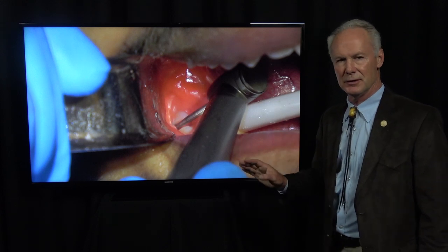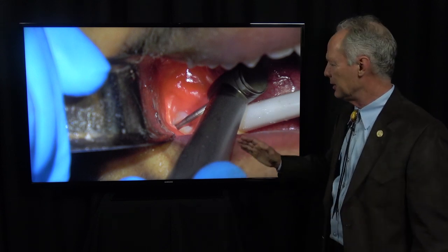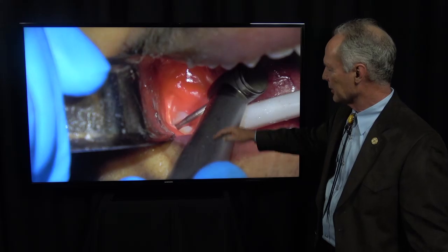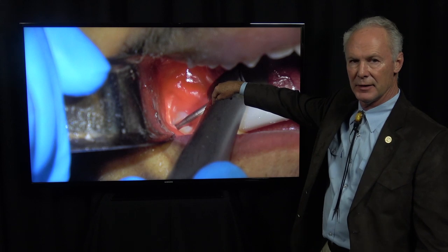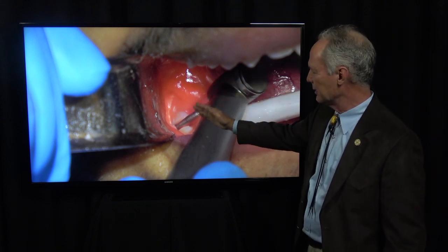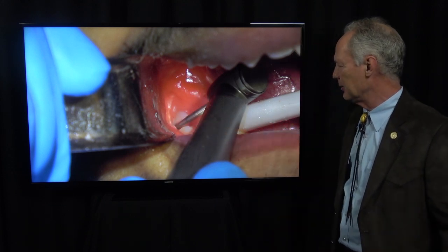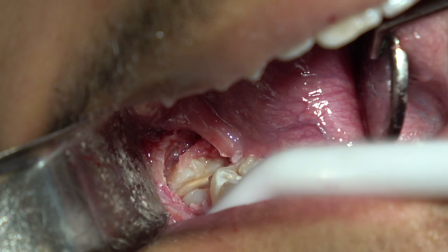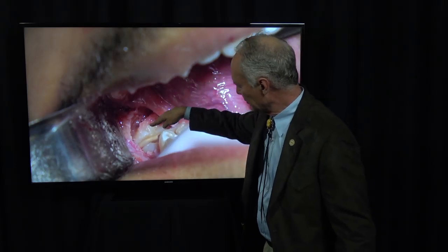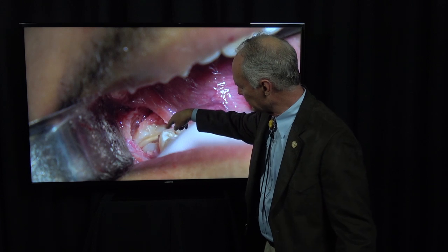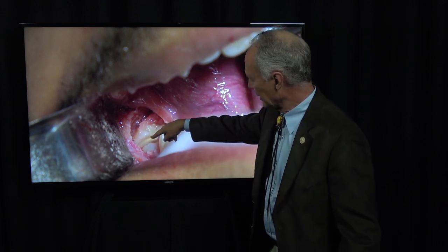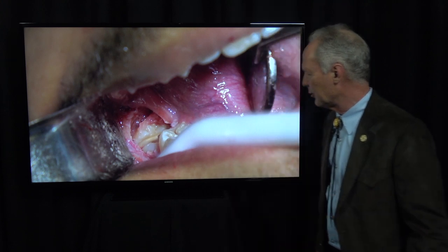It's very important if you're using a high-speed handpiece that you not reflect the lingual tissue, because you don't want to create an air embolism — that's from air getting down into that lingual tissue. So don't reflect the lingual flap. You can reflect the facial flap, but not the lingual flap. Use lots of water. The tooth angles this way, so I'm making my cut through the occlusal to the furcation all the way through.